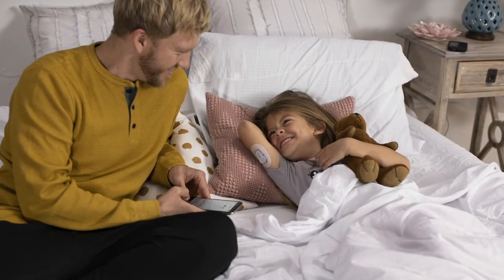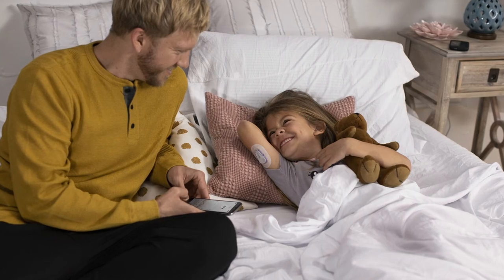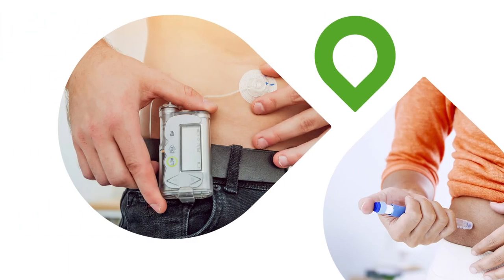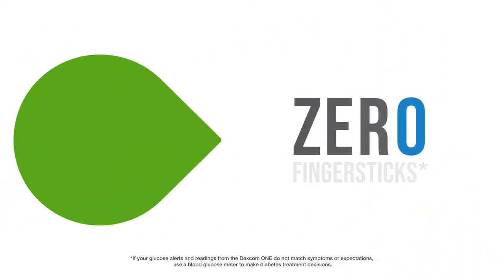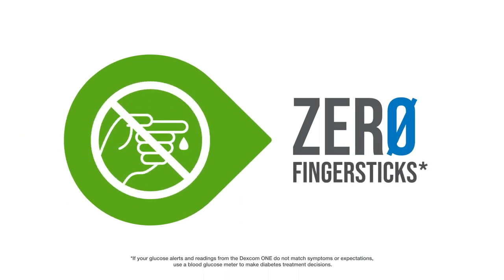Red means that you're below your low glucose threshold, yellow means that you're above your high glucose threshold, white means that you're within your target range — so much information available with just a glance at your smartphone. The Dexcom technology is approved for making diabetes treatment decisions without a confirmatory finger stick, and you don't need to calibrate the sensor either. Yes, that means zero finger sticks with Dexcom CGM.